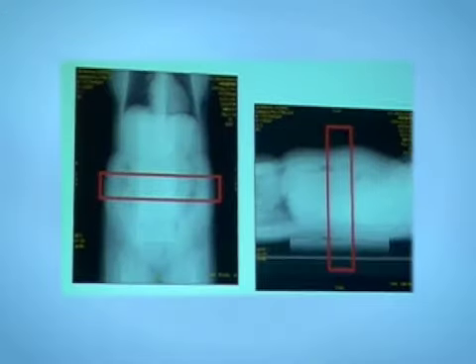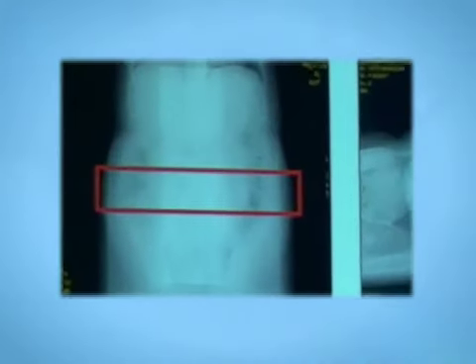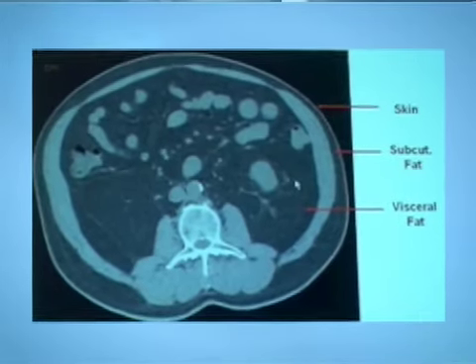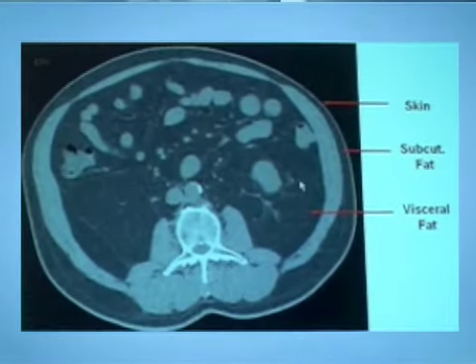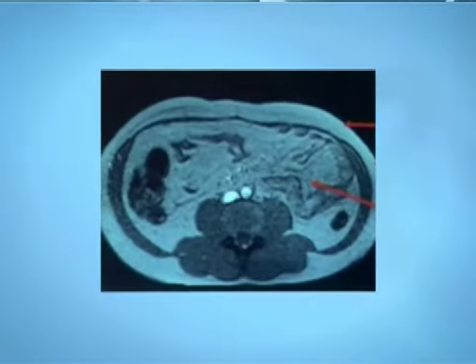Both CT and MR, I would say, provide the most information on specific fat depots. I think we've evolved over the past 10 years so that this adds a significant amount of new information compared to bone densitometry or DEXA body composition. So I think compartment-specific measurements of fat in the abdomen, around the heart, or in the liver are much more important than overall total fat burden. I think it's still a research tool.